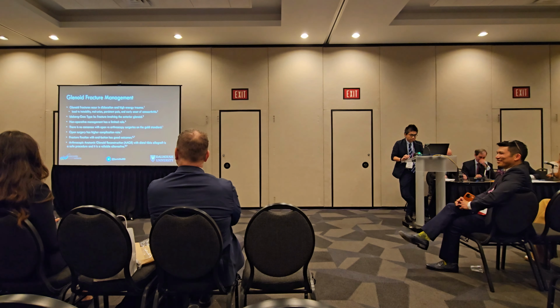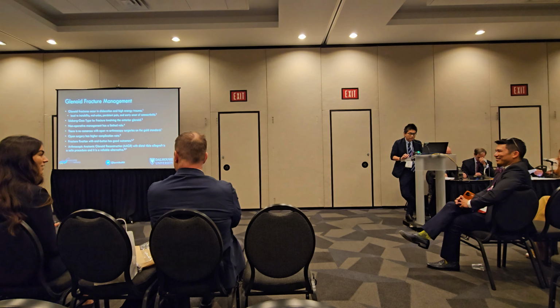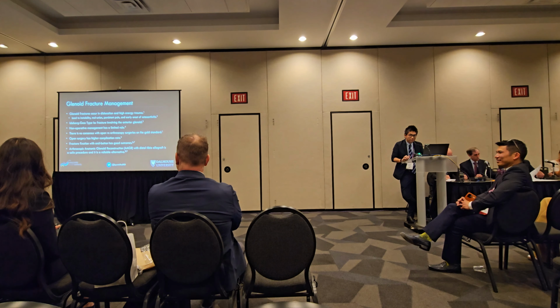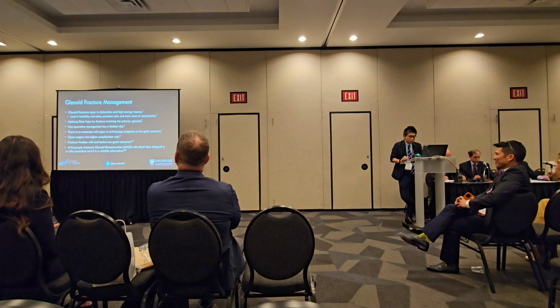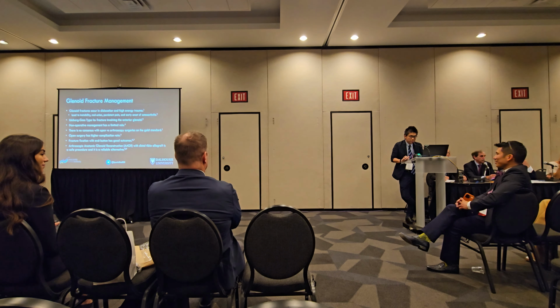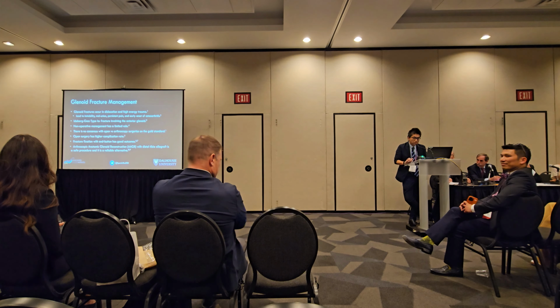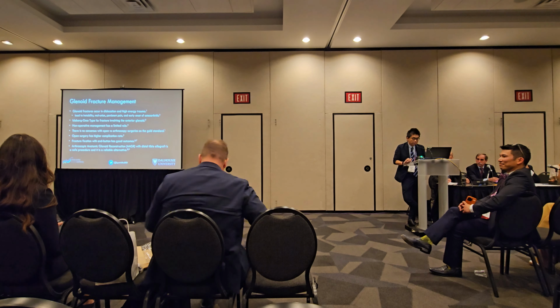In surgical treatment, open and arthroscopic surgeries are selected. However, open surgery has high complication rates with neurovascular injuries. In arthroscopic surgery, arthroscopic reduction and internal fixation using EndoButton, and arthroscopic anatomical glenoid reconstruction using distal tibia allograft are both selected.